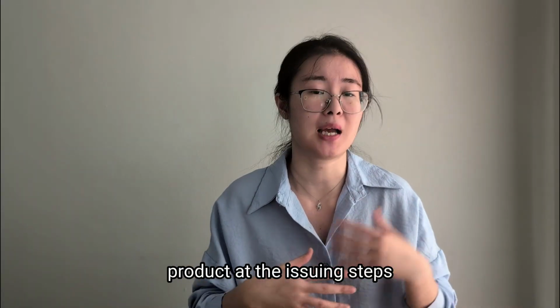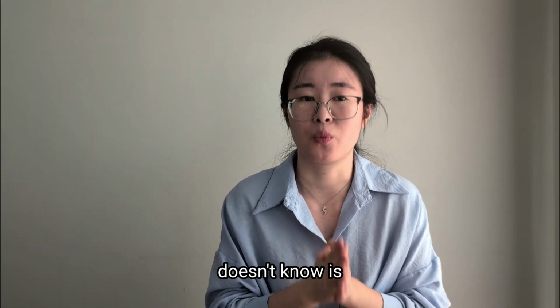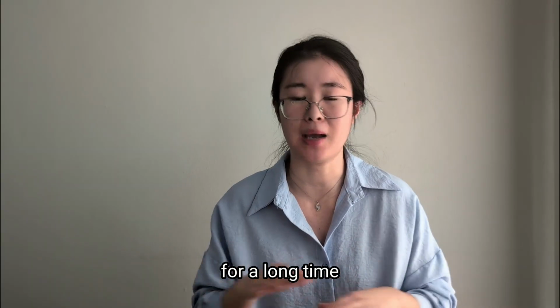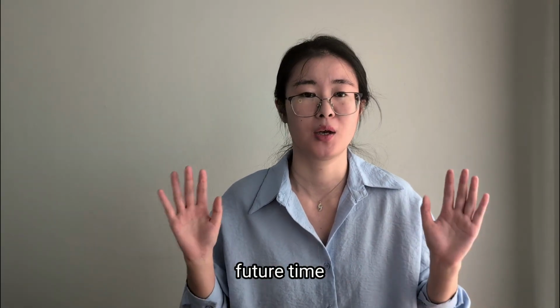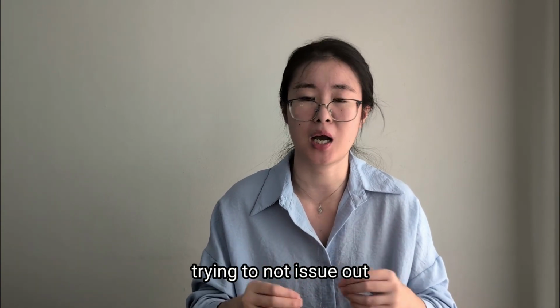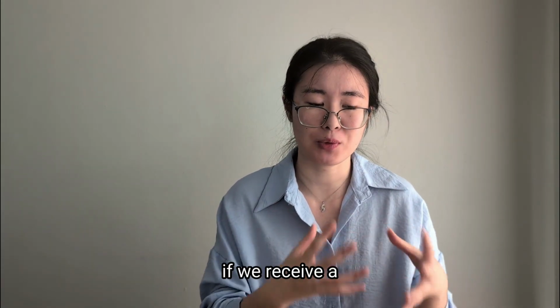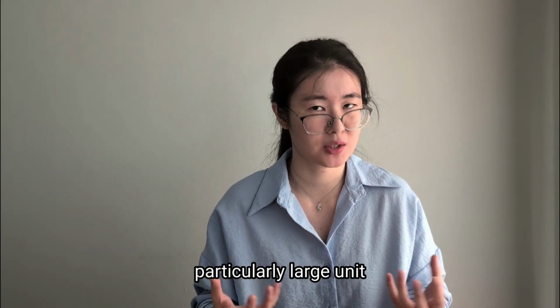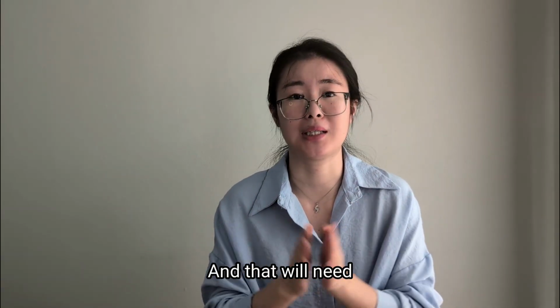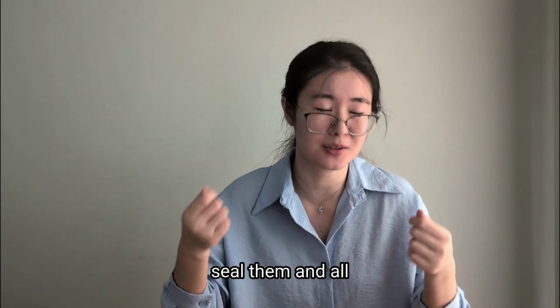And for the non-frozen product, at the issuing step, there are also many things that could happen. One of the things a lot of people don't know is we are on an extreme platelet shortage nationwide for a long time and it won't be getting any better in the future. So what happens now in the blood bank is we are carefully trying not to issue out more platelets than needed. Occasionally, if we receive a particularly large unit, we may spend some time to split that into two smaller units. That will need us to warm up our little seal machine and then cut the lines and seal them and all that stuff.